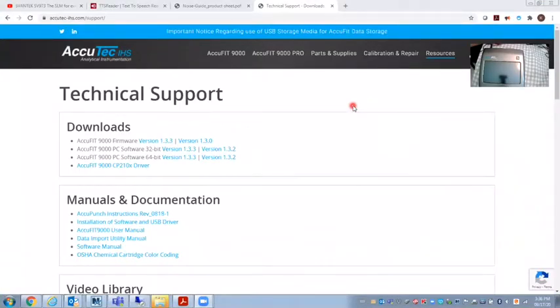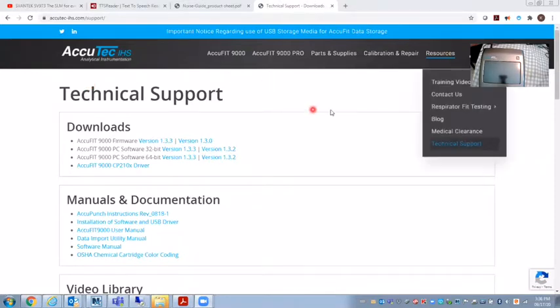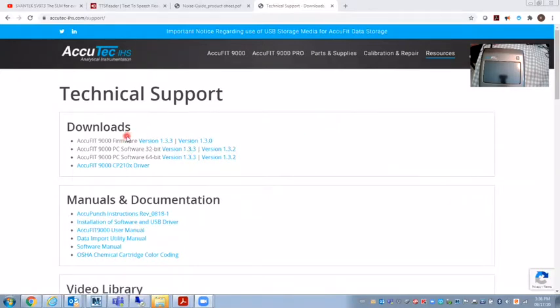Today I want to show you how to update the firmware on an AccuFit 9000 fit tester. First, I've gone to the AccuTech website under Resources, then Tech Support. You have all these downloads — the firmware, which is the internal software of the AccuFit 9000.